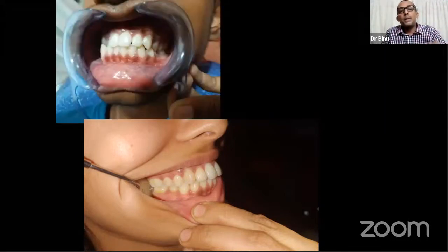Another one here. The doctor decided to use a cheek retractor. Thank God. That is fine. But the light is not evenly distributed. Too much of dark areas here. Why is that? Because the flash of a mobile phone many times might go in a different direction. If you look at iPhone or any other phone, when you try to focus onto the mouth, the flash might be going in a different angle altogether. So you may not get good light here. You know what? All you have to do is take your chair light, ask the assistant to focus it there, and take with your mobile phone.